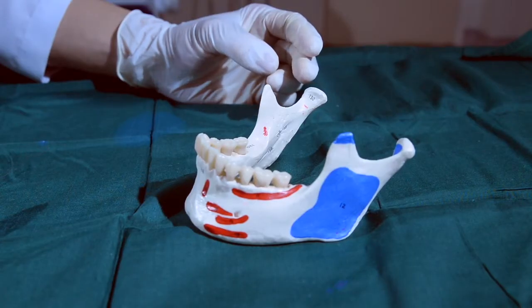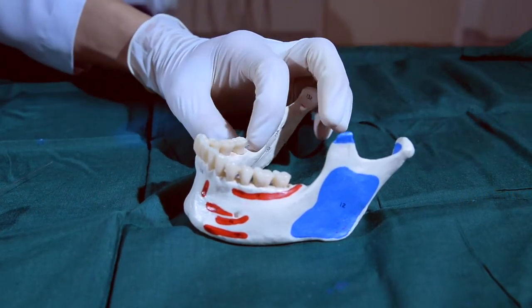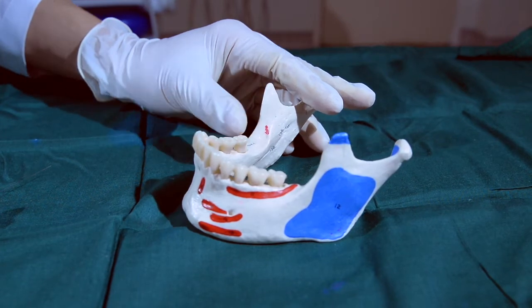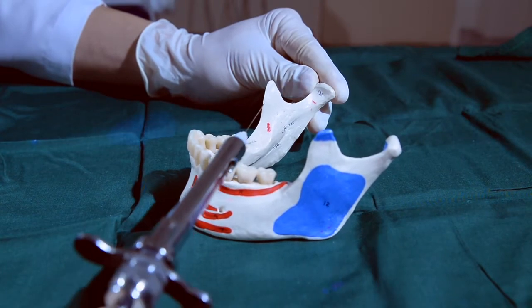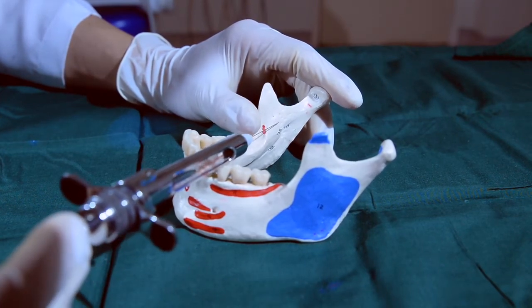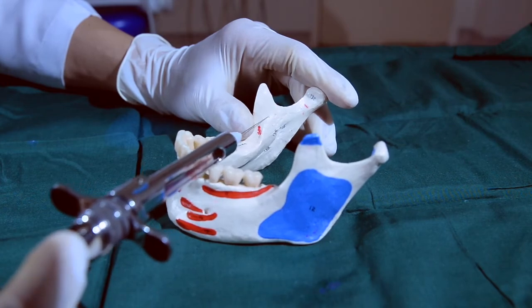For the approach and landmarks of the inferior alveolar nerve block, we palpate and feel the anterior border of the ramus and the internal oblique ridge. We stretch the soft tissue with our thumb to expose the pterygomandibular raphe and fossa. The needle is approached from the contralateral premolar, 1 cm above the occlusal plane, with the middle of the thumb as the reference point. The depth of injection is 20–25 mm until bone is touched; if bone is not contacted, the needle must be repositioned.